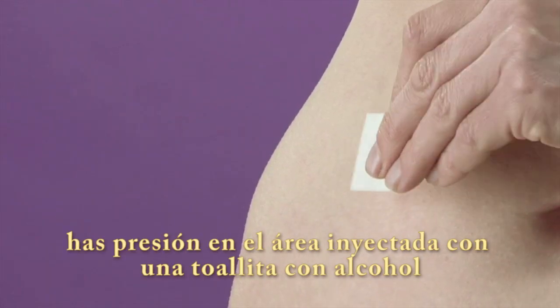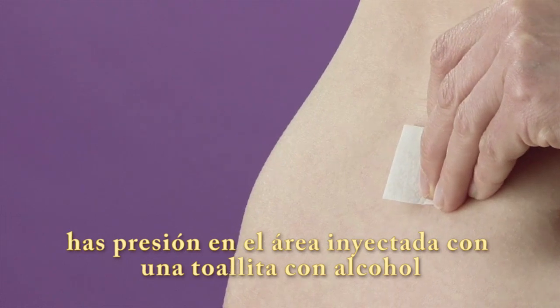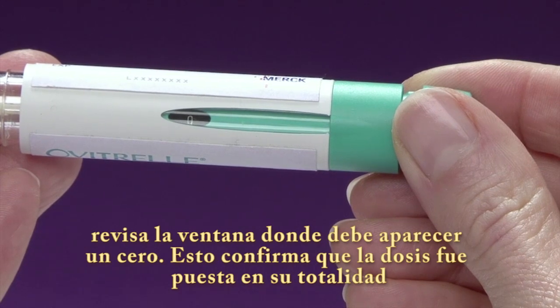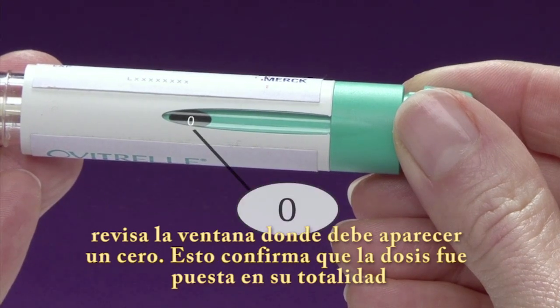Apply pressure on the injection site. Make sure you have given yourself a complete injection. Check that the dose window shows 0. This will confirm that the dose has been delivered completely.